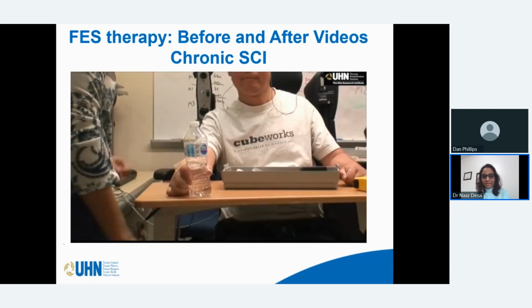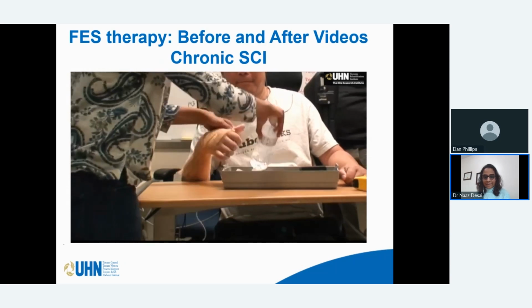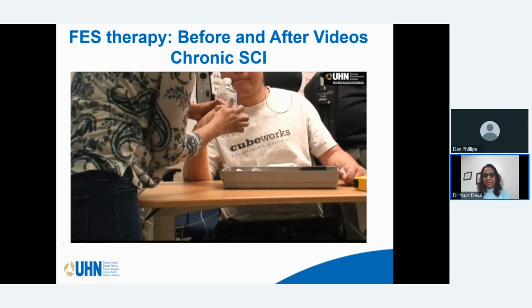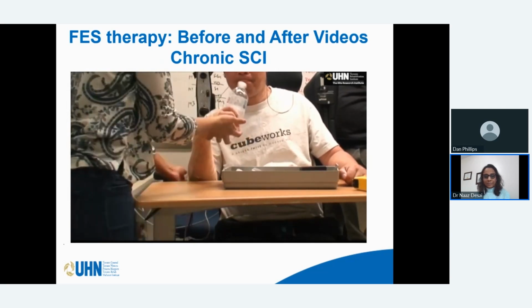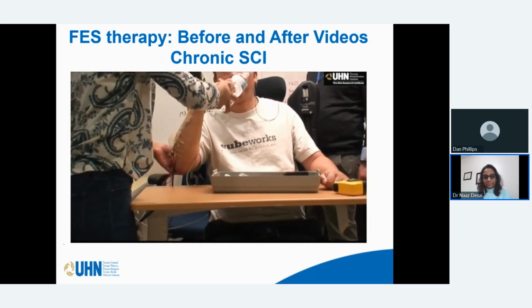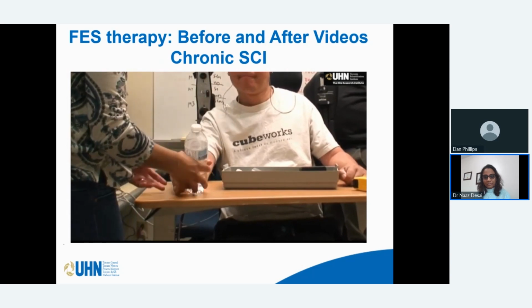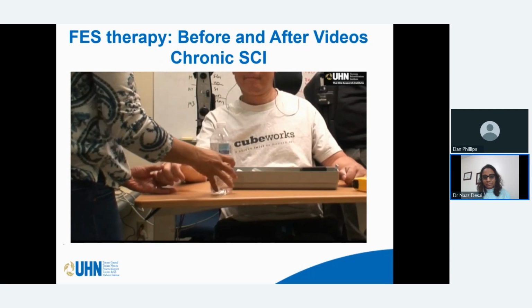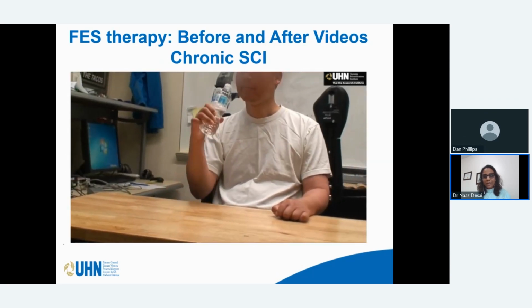So this is session 6, and this is without the assistance of FES. This is just him trying to bring the bottle to his mouth and drink out of the bottle. And this is after 33 sessions of FES.